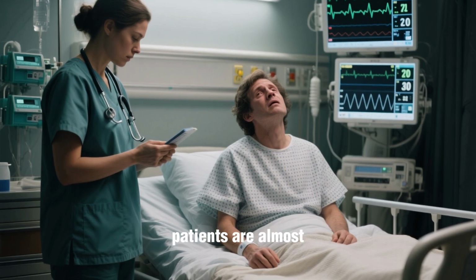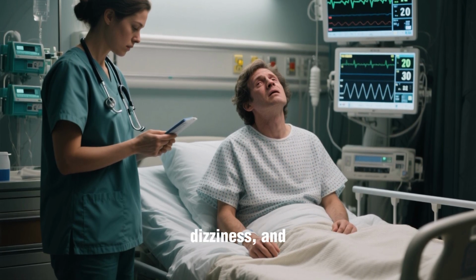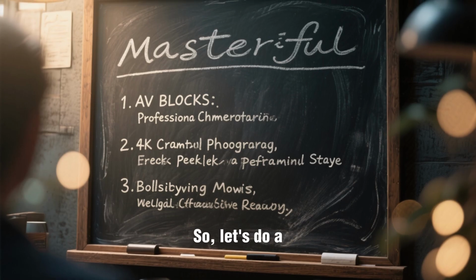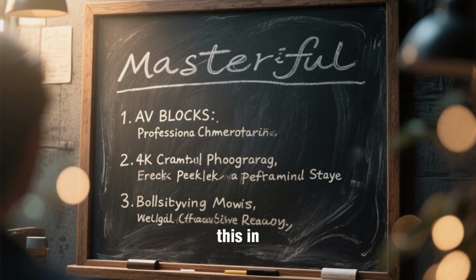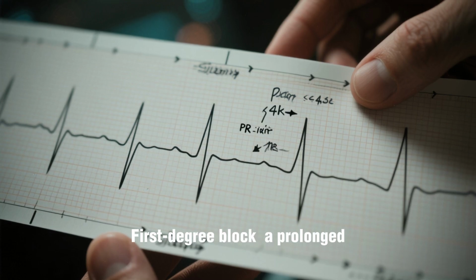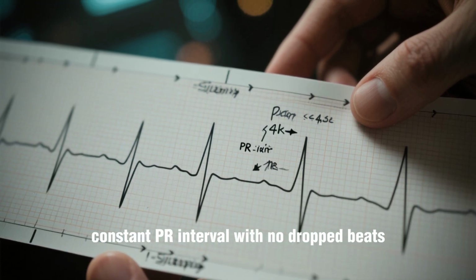Clinically, these patients are almost always symptomatic with significant bradycardia, dizziness, and fatigue, making them a medical emergency. So, let's do a quick recap to lock this in. AV blocks are high-yield must-know rhythms for your exam. First-degree block: a prolonged, constant PR interval with no dropped beats.